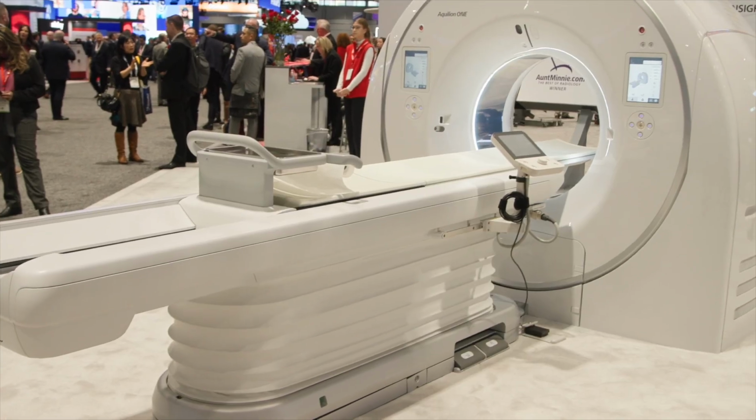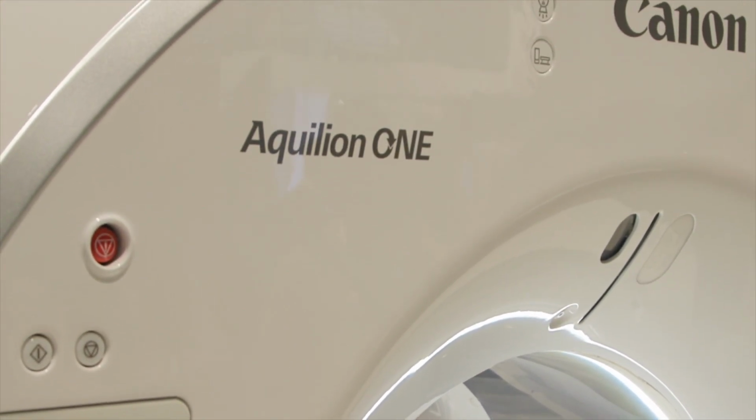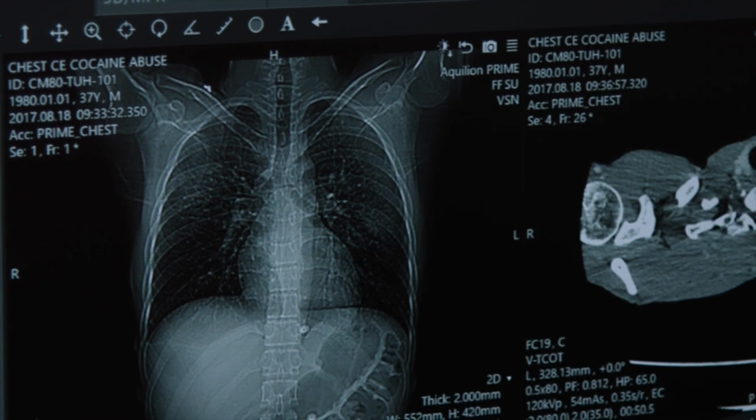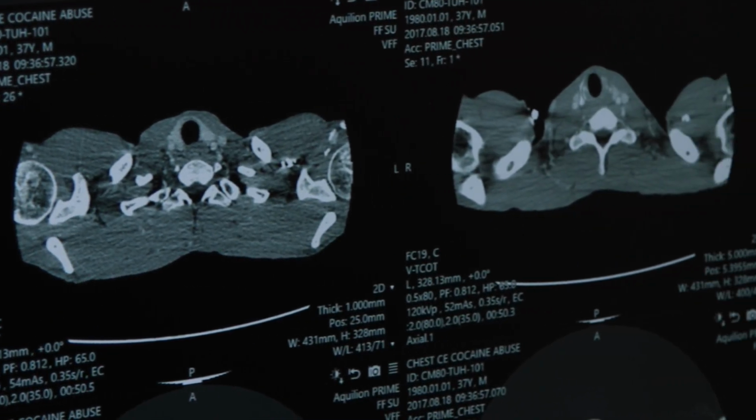Right. So when you do cardiac imaging, the scanner that you really need is the scanner which is sharp enough, which is fast enough, and which is easy to work with. Otherwise, if you have the best scanner which is sharp and fast, and it's so complex to work with, you're going to find a few techs who can work with it, but the rest of your personnel avoid using it. So I think this is the key element for us: having the scanner which is sharp. And when I say sharp, it produces the images with the highest resolution possible. And fast means that the images are motionless.